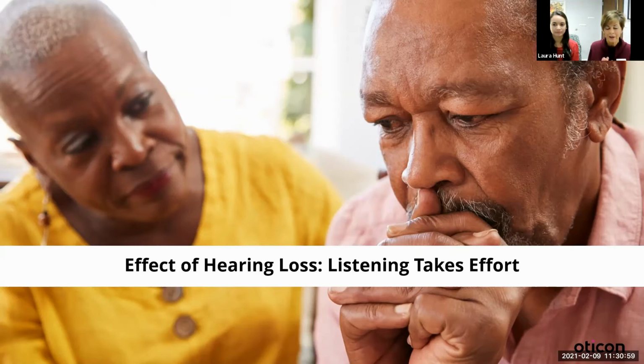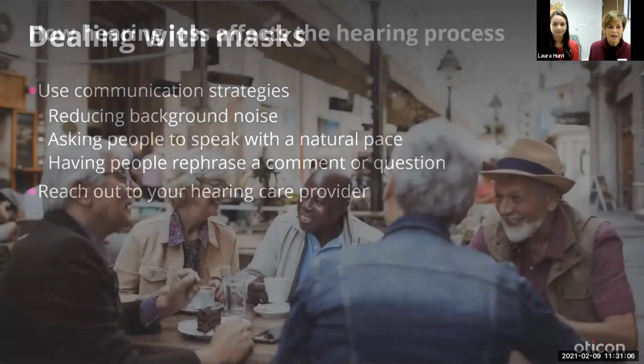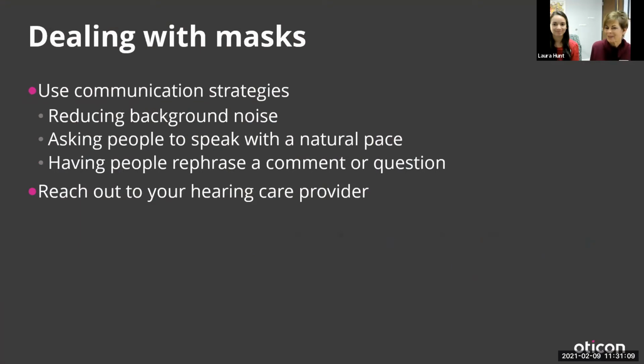But until that time, that is one of the key things that we can do to help you. So dealing with the masks, we know that some of the strategies that Shalise has just put up there, as far as reducing background noise, asking people to slow down, and have people rephrase. Those are normal things that most of you are very good at doing, even in normal conversational levels and normal situations. But during this very difficult time, I would encourage you to come in and get the mask program, because the effort is fatiguing. And we understand that it is.